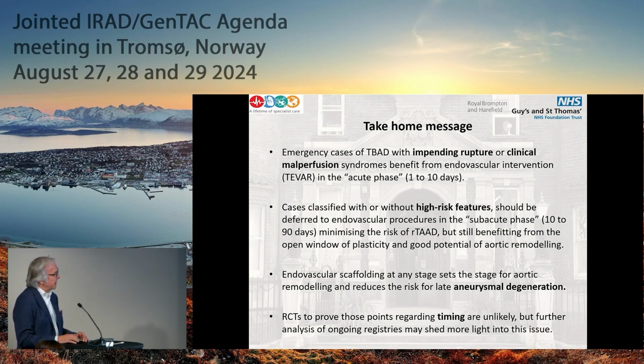Endovascular scaffolding at any stage sets a stage for remodeling and reduces the risk of late aneurysmal degeneration, and RCTs to prove those points regarding timing are unlikely to happen, but further analysis of ongoing registries may shed light into this issue.